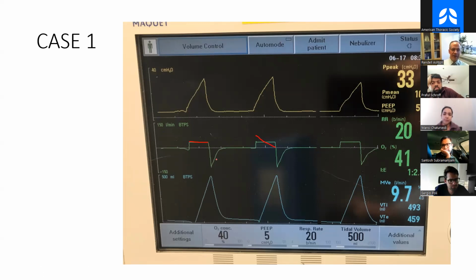The way that I think you can think about this is if you think about exhalation. So here's the flow channel here. Any inward flow is above the line, outward flow is below the line. So exhalation is always down here, right? Everybody with me? And in almost every case, nearly every single mode, and there's like 200 modes, exhalation is a passive pressure control phenomenon.